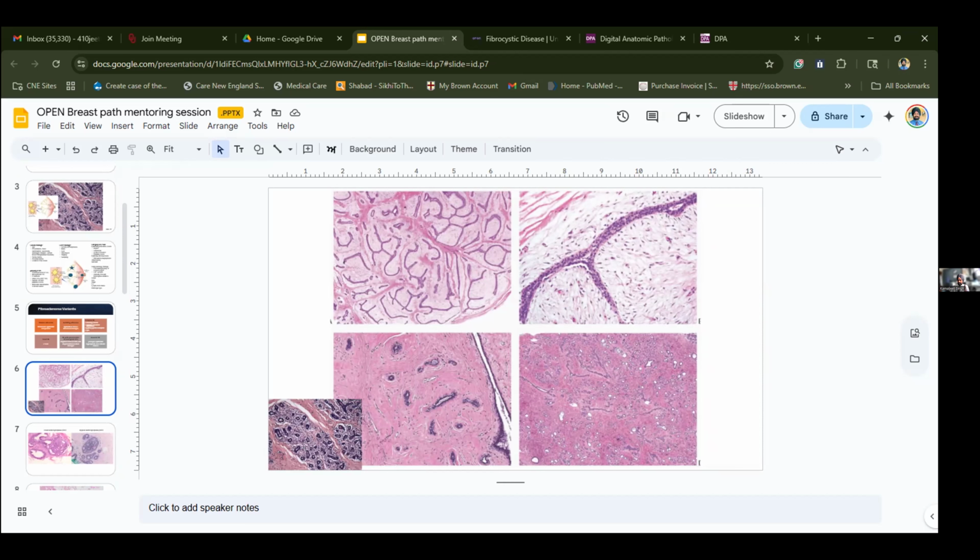So essentially, these blue circles are the epithelial component, and the pink connective tissue is the intralobular stroma. Both of them have hypertrophied and increased in number to create this fibroadenoma. So knowing the etiopathogenesis helps you understand where this is coming from. Why is it in the periphery of the breast?